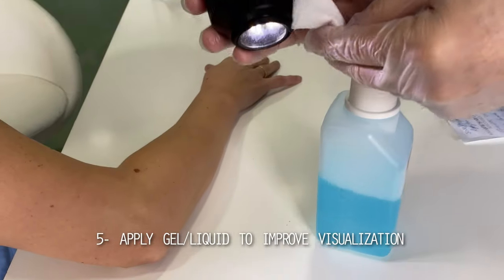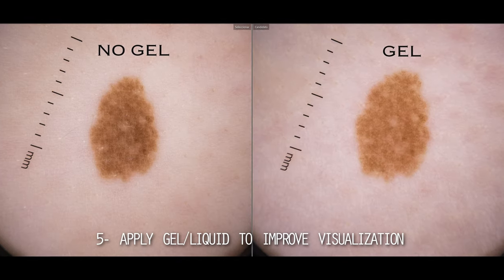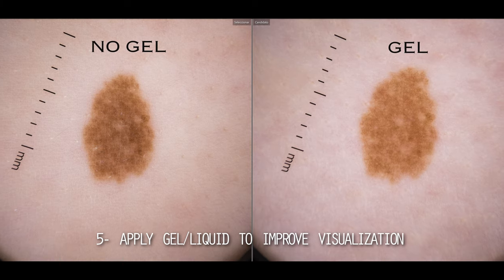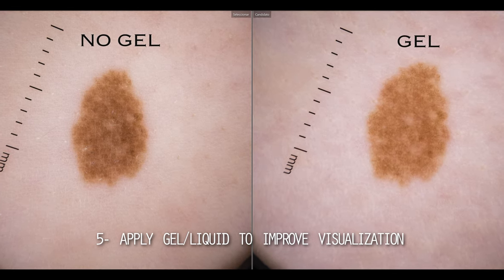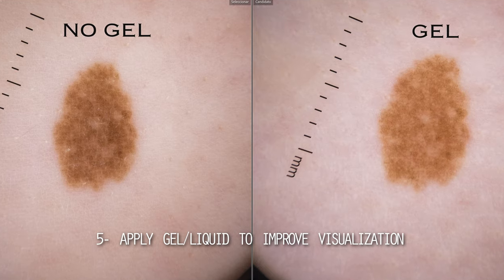The fifth recommendation relates to the use of immersion gel or liquid to see in detail the typical structures. However, if you want to preserve certain characteristics such as hyperkeratosis, I suggest you take a previous picture without the gel.